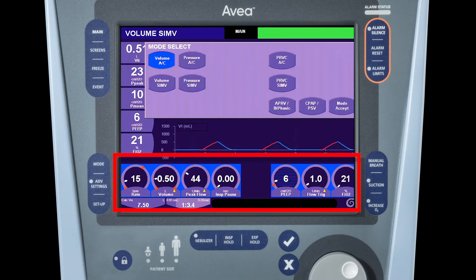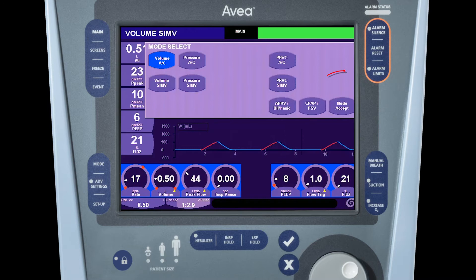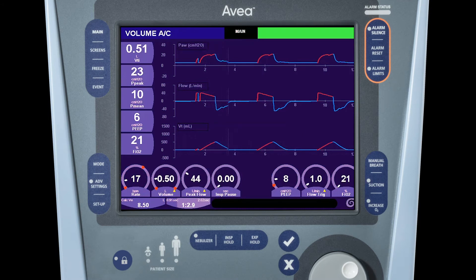To do this, select the controls you wish to change through the standard three-step touch-turn-touch process, get them set to the level desired, and then press the mode accept button on the mode select window. This will execute the changes in the primary and/or advanced settings as well as the mode.